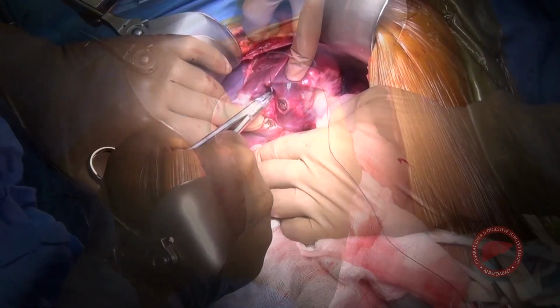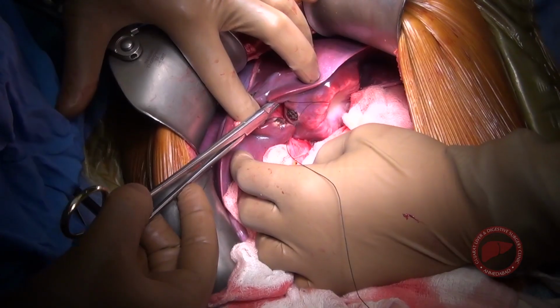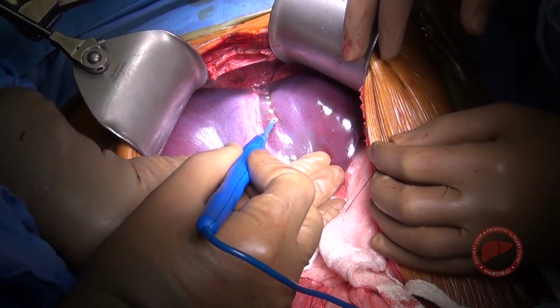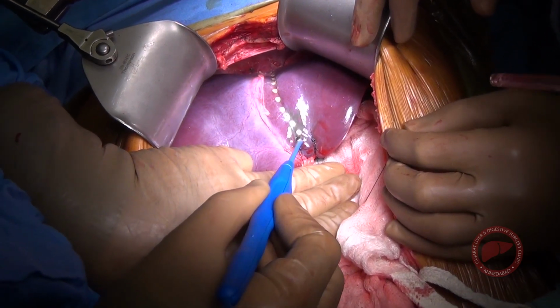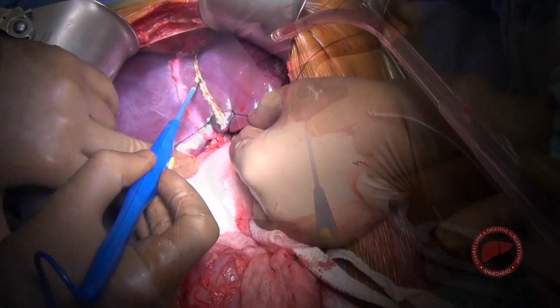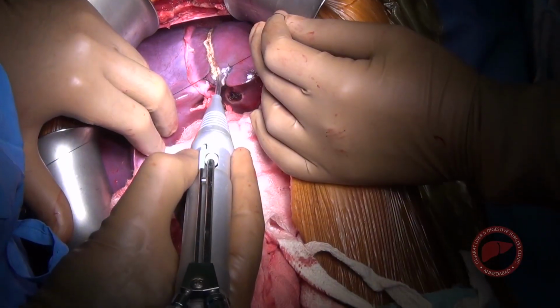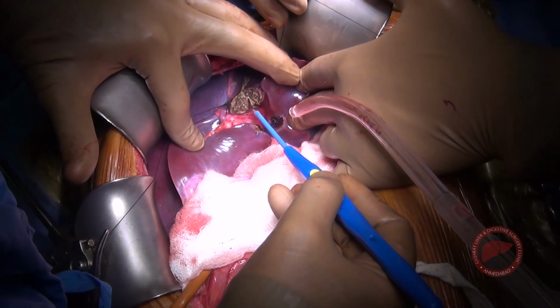The left lateral segmentectomy was performed first, so the stay sutures were taken on both sides. The line of transection was marked on the liver surface with the help of diathermy. Parenchymal transection was performed with the help of monopolar and bipolar diathermy and CUSA.